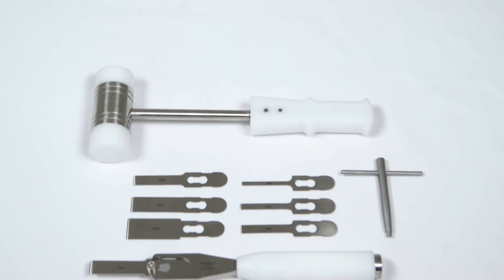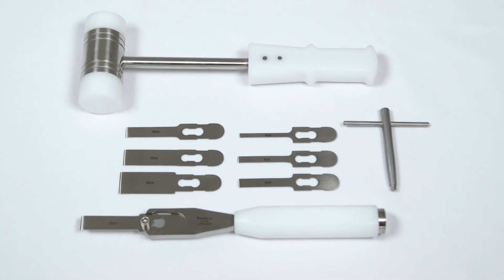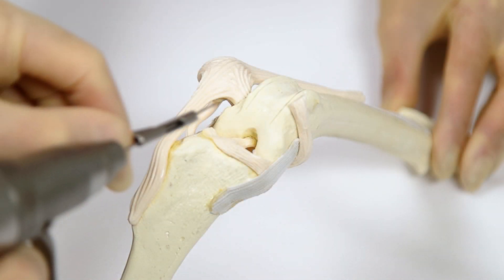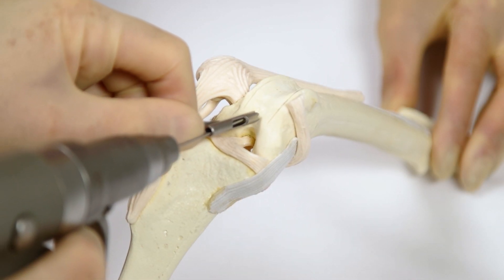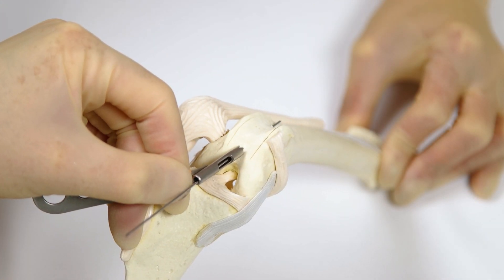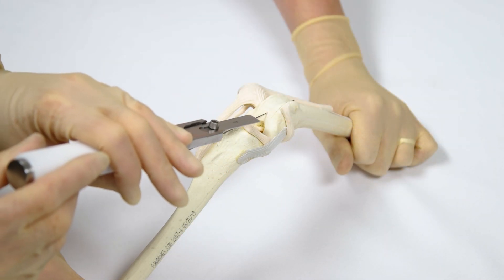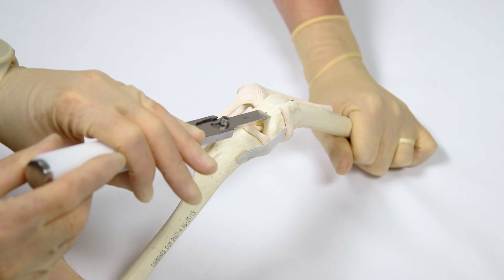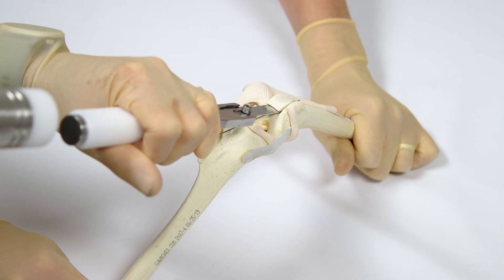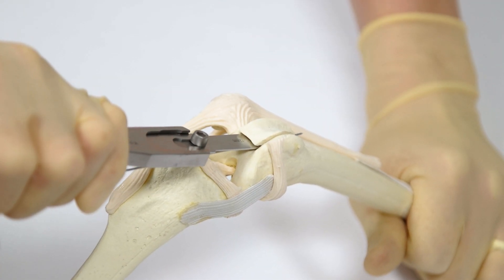An osteotome and mallet are used to cut the base of the block. A modular osteotome is recommended as the blades are thin, which reduces the chance of fracturing the block. Pre-placing a K-wire can help to guide the osteotome, avoiding going too deep and avoiding going too superficial, which can cause the block to fracture. The base of the block is cut from distal to proximal. The starting point is just cranial to the intercondylar notch, and the finishing point is the osteochondral junction of the trochlear groove proximally.